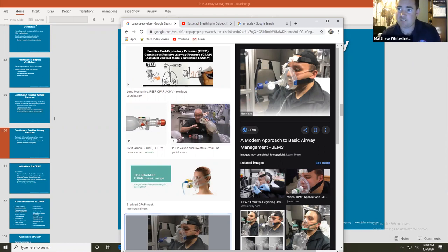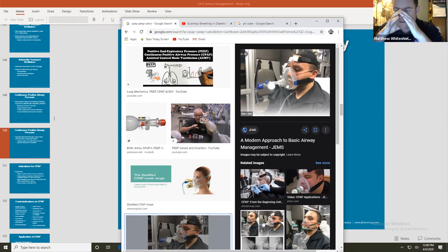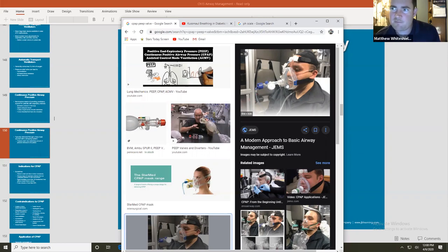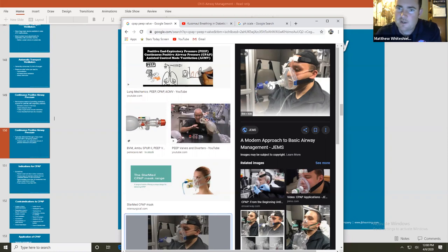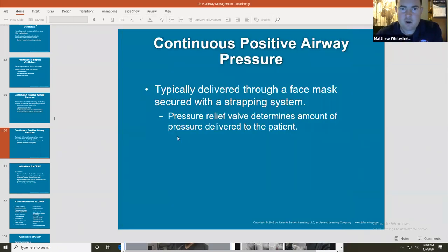I'll start at around 10 liters per minute. I make sure it's on their head completely and everything's tight. I take my hands and place them around the patient's face, feeling for any air leak. If I feel one, I readjust my straps. Once straps are tight, I pay attention to my flow meter — every single time my patient exhales, I'm going to see that flow meter move, which tells me how much PEEP I'm delivering.